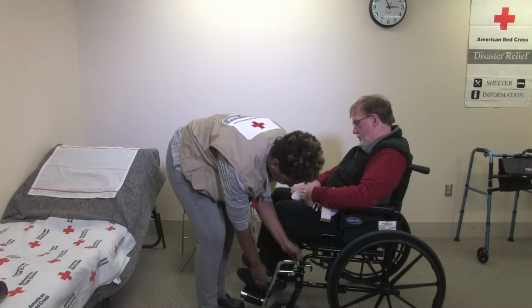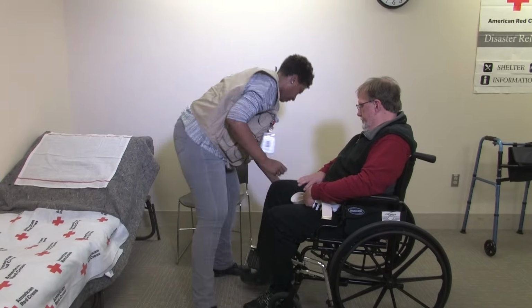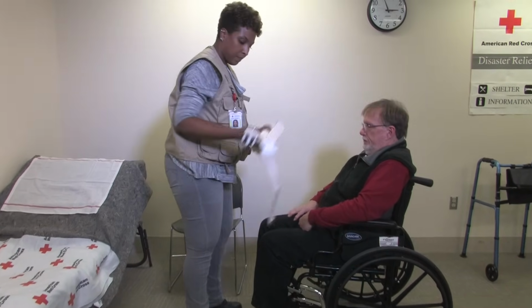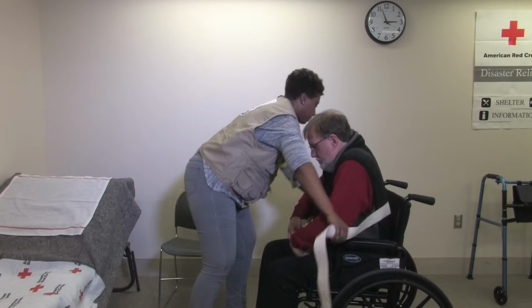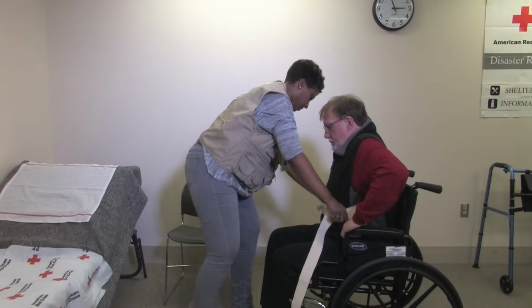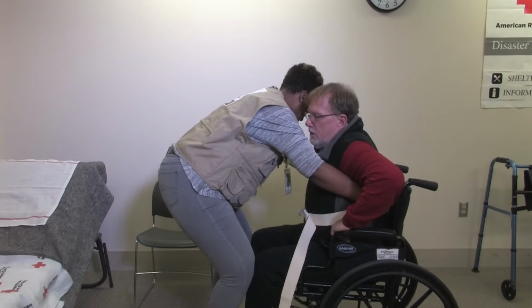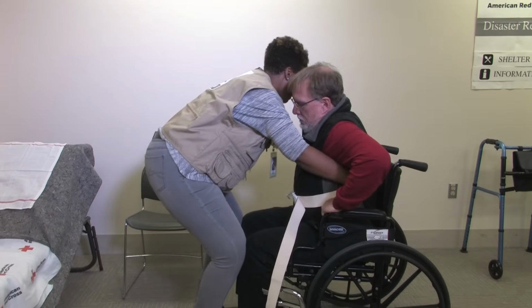So I'm going to, there you go. Thank you. I'm going to put the belt back on you. Yes, thank you. Put this around your waist. And we're going to do this on the count of 3 again. Okay. 1, 2, 3.